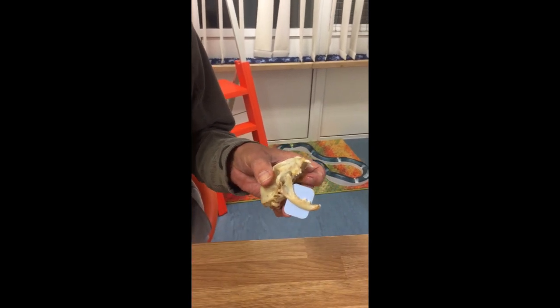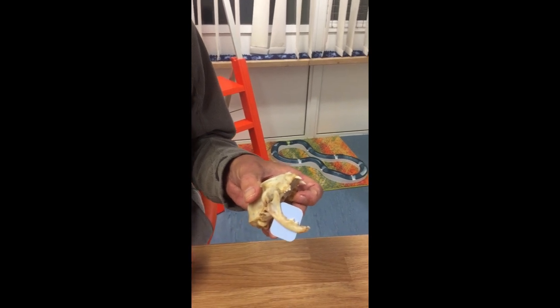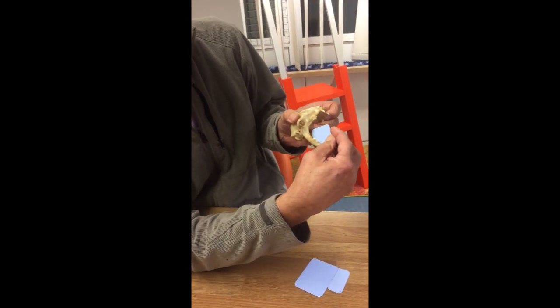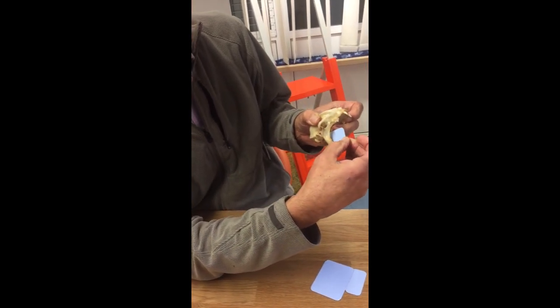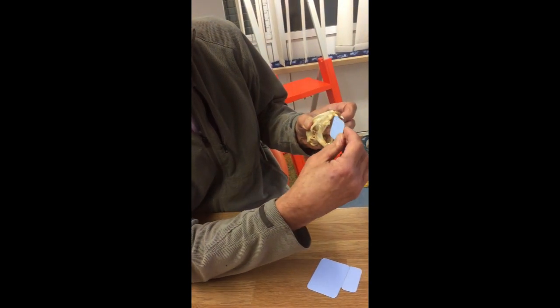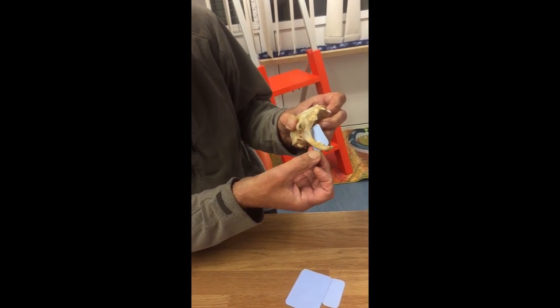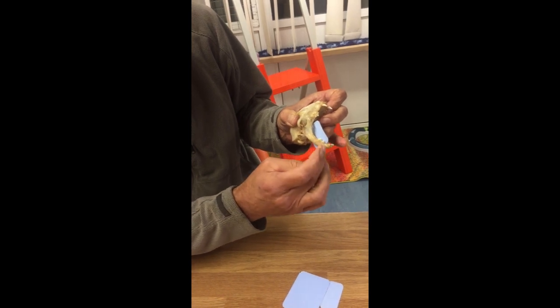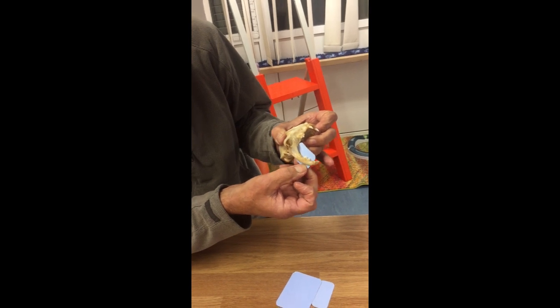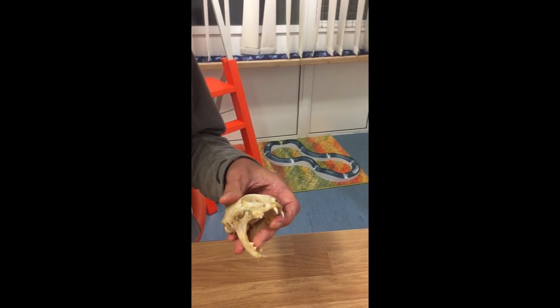So we would then just come in with our beam perpendicularly, and it's obvious that's going to give us a nice, clean, straightforward image. One little trick here, we'd automatically tend to stuff the plate in that way there, because that's the way it wants to go. But then we may then miss the mesial roots of the first tooth. If we then jam it in the opposite way, then that pushes the plate much farther into the symphysis, so you'll get that front root there quite happily. So that's the mandible, nice and easy intraoral parallel view.